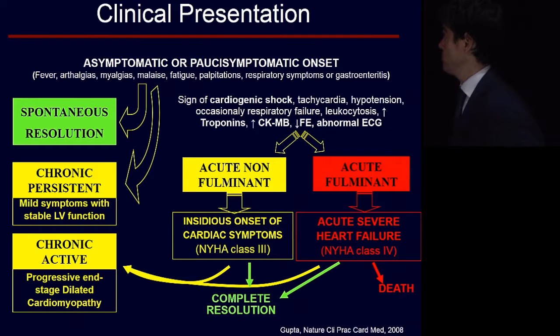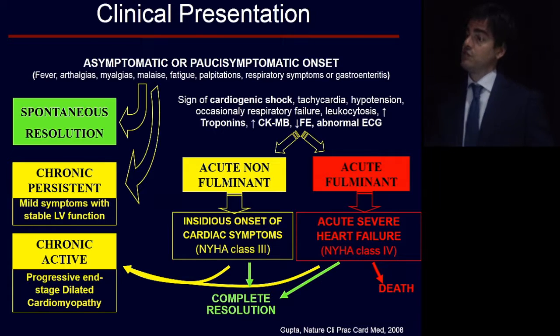You may have an acute non-fulminant form or an acute fulminant myocarditis, like the case I showed you before. And this, unfortunately, may conclude in acute heart failure and sudden cardiac death, which is one of the manifestations of myocarditis. Again, why should we care about this clinical insight? Of course, we want to be clinical radiologists as we are competing with cardiologists. But what is also extremely important in this regard is to consider how clinical presentation may have an impact on the diagnostic performance of MRI.